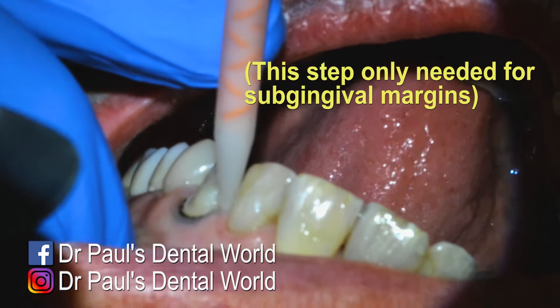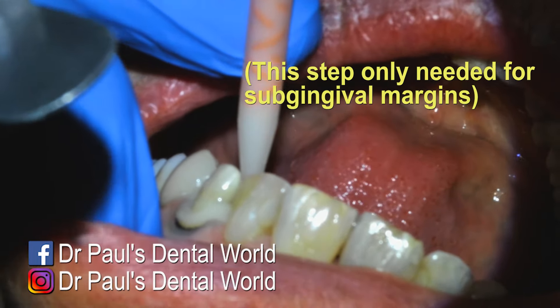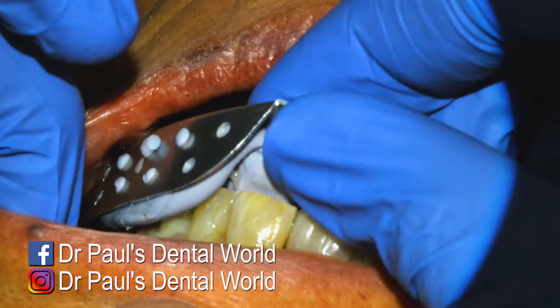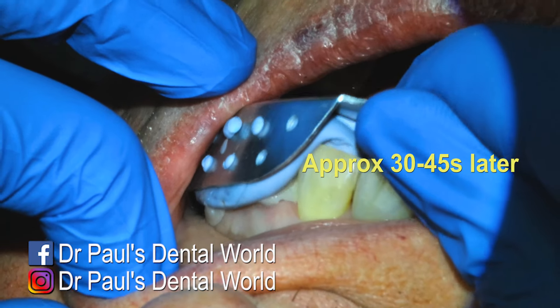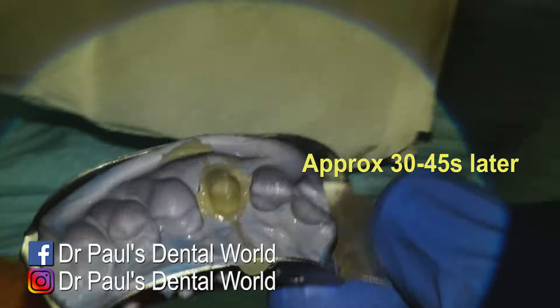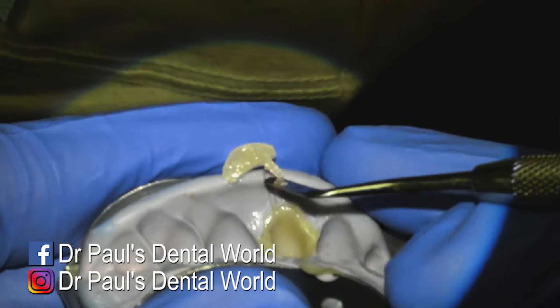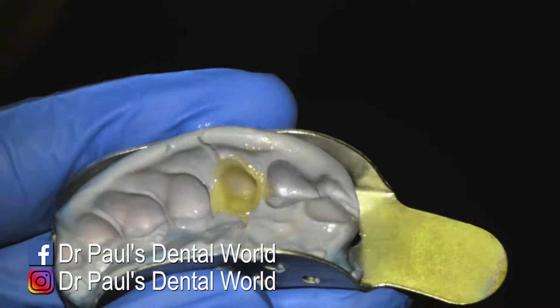Now this next bit — if you have a subgingival margin, you can actually put the temporary material on that margin first, just to make sure that you capture that area really well and get no air bubbles. Pop it over the top. You can see the excess comes out, and then once it's set, you take it out. Now before it's completely set, I will use a flat plastic to get rid of the channels and then I'll wait another minute or so for it to set nice and hard.